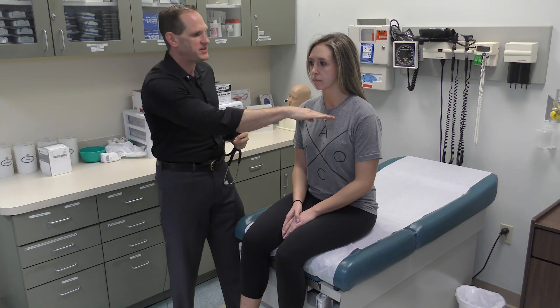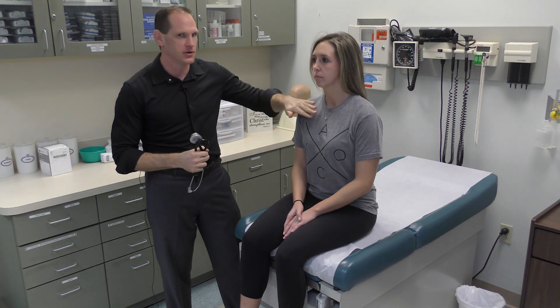So we went down with the diaphragm and back up with the bell. What you're hearing is boom-boom, boom-boom — those two sounds are S1 and S2. S2 is formed by the semilunar valves at the base, so it's heard best at the top. S1 is formed by the mitral and tricuspid valves. At the top you'll hear one sound louder, and at the bottom you'll hear the other louder, depending on where you're listening.